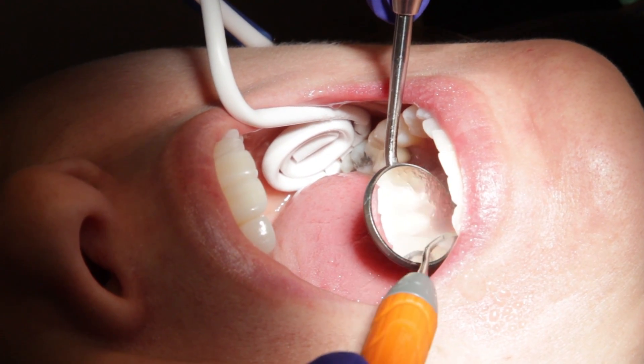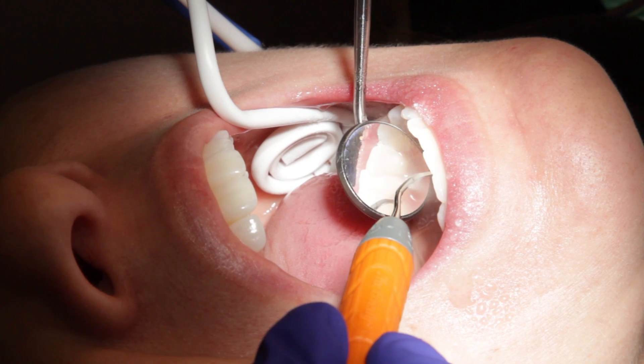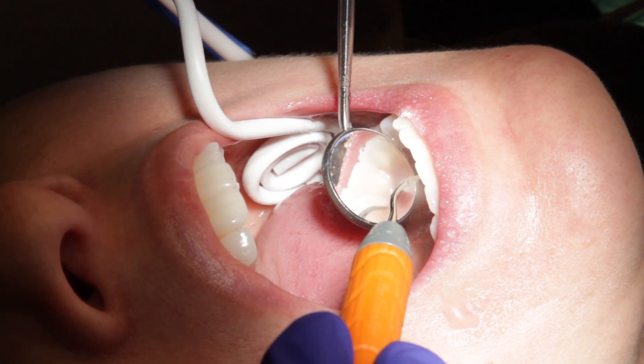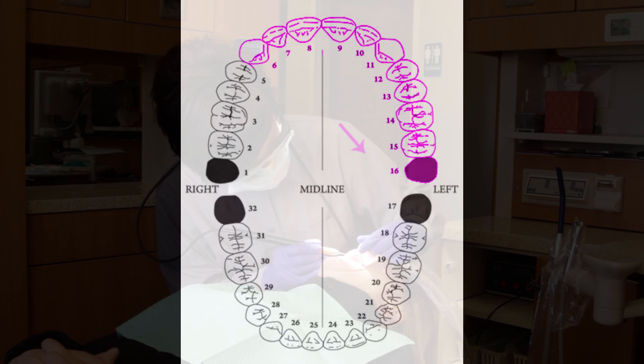With a mirror, the lingual surfaces of the anterior teeth are easy to see. Clinical proficiency is greatly enhanced. Repeat the pattern on the maxillary arch. Start with number 16 buccal and end at number 6, the cuspid. Rotate onto the lingual surfaces and work from tooth number 6 back to tooth number 16.